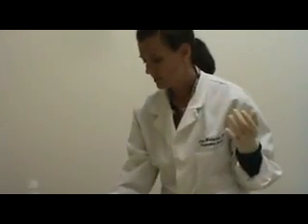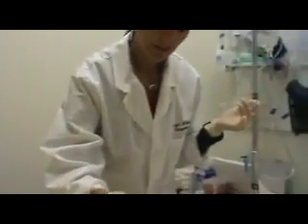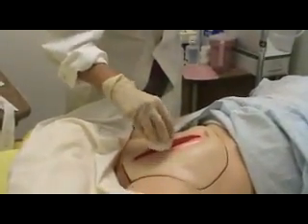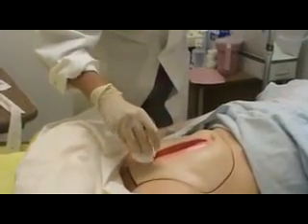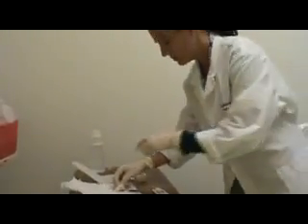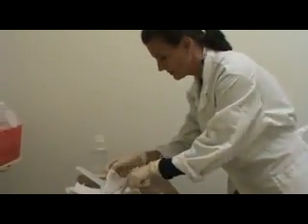So I'm going to pick up my dry 4x4 and then pat the wound bed to remove any excess saline that may have gotten in the wound bed with the cleaning. And I will dispose of that. Next, I will pick up my wet 4x4. The first one, I need to separate them out. And I'm going to open up the 4x4. No, I need to bring it out first.